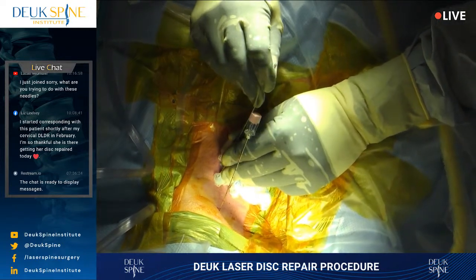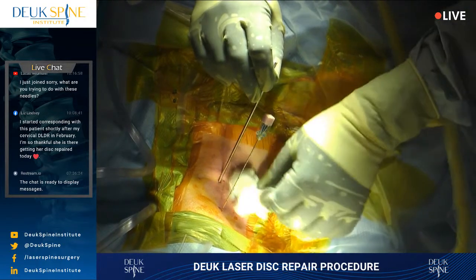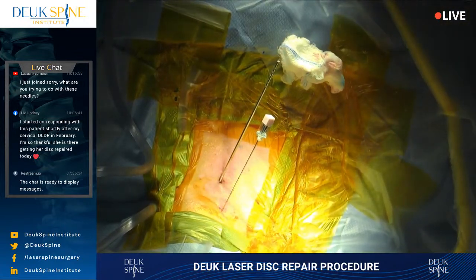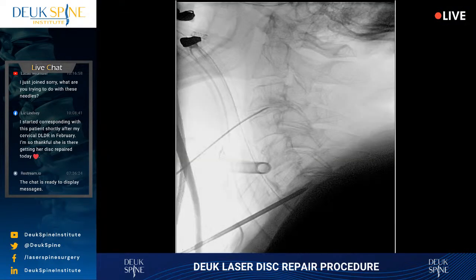And I'm just gently twisting this in. I can feel it with my fingertips, okay? Now I've gone as far as I can with my fingertips. If I push harder, I may suddenly give and go into the spinal cord. It could paralyze a patient. We don't want that. So I'm going to use a hammer.